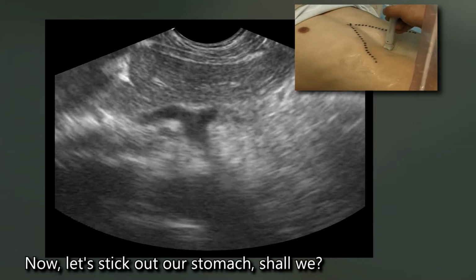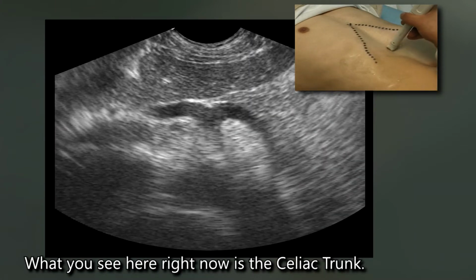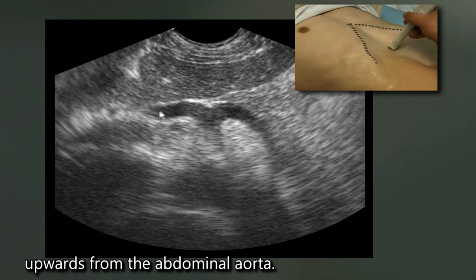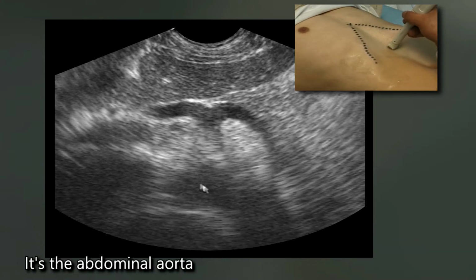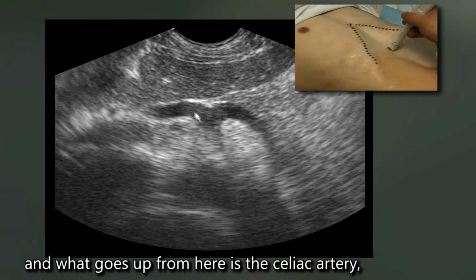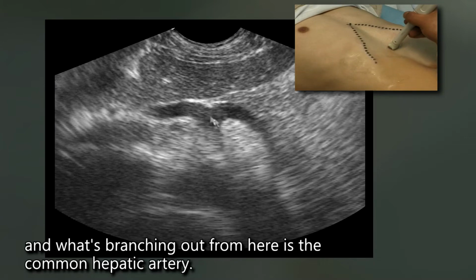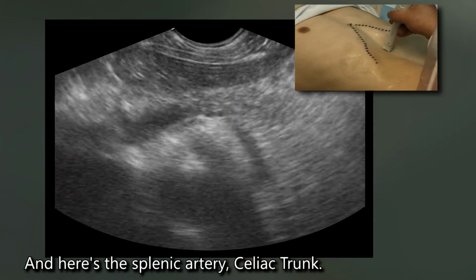Now, let's stick out our stomach, shall we? What you see here right now is the celiac trunk. The celiac trunk is the celiac artery, going upwards from the abdominal aorta. It is called a seagull sign, because it branches in the shape of a seagull. It's the abdominal aorta, and what goes up from here is the celiac artery, and what's branching out from here is the common hepatic artery, and here's the splenic artery.